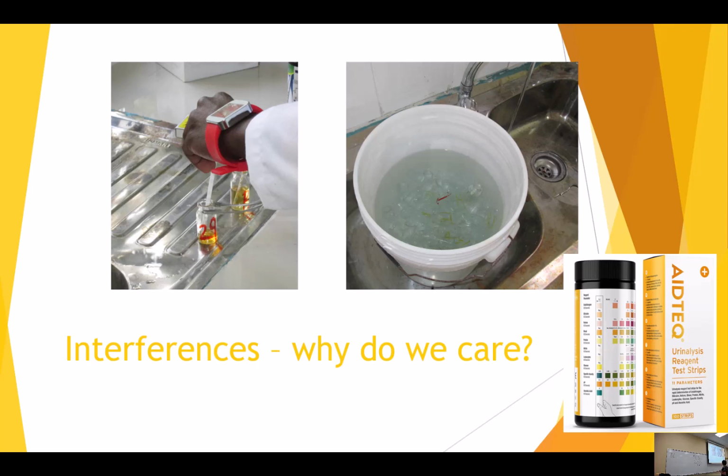They actually collected this urine. They put this number on it. They have a paper log, the number 29, with a patient's name next to it, and then all the test results go right on that log. So that's their only identification of this urine, this 29. When they're done, they take it and dump it right into this big bucket of bleach water. And you can even see there's actually urine. You can see some of the yellow still in the vials.